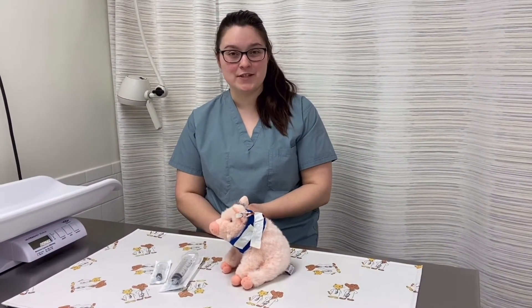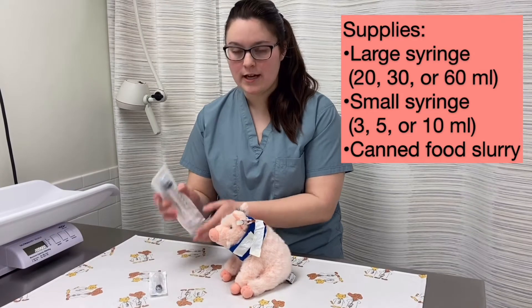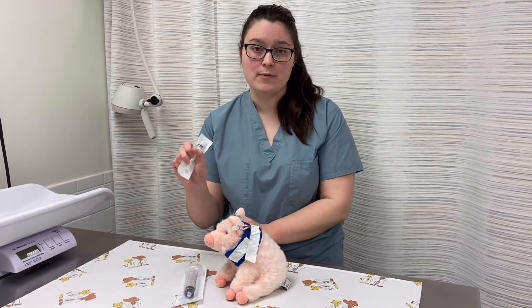Hi, today I'm going to teach you how to feed your pet through its E-tube. When you get home, you're going to have a couple of different types of syringes. You're going to have large syringes that are either 20, 30, or 60 mils, and you're going to have a couple of 6 mil syringes.